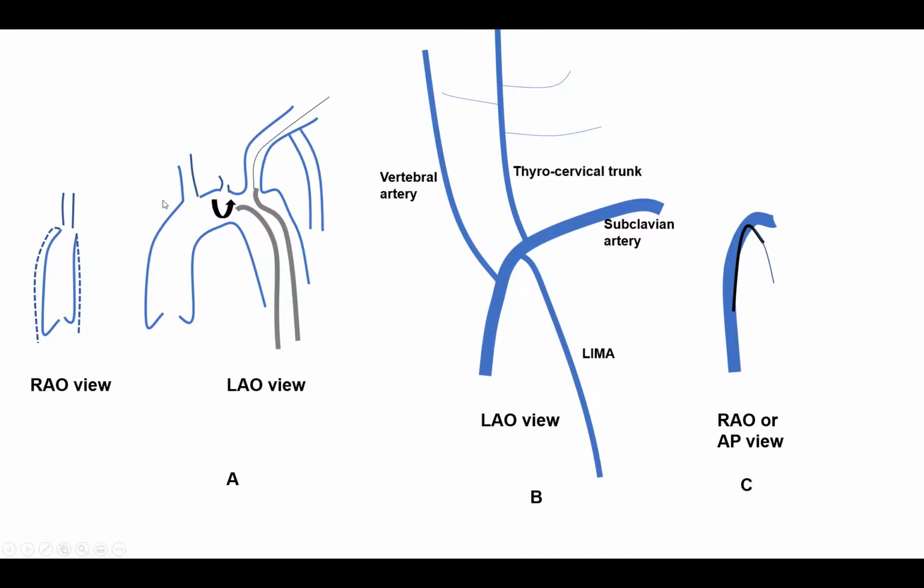Okay. Now, what maneuvering do you do for that? I mentioned counterclockwise to get into the subclavian. To get in the LIMA, it's usually counterclockwise, slight counterclockwise. Occasionally it is clockwise, but the idea is just know this anatomy and make it point down, whatever you need to do. If counterclockwise points you up, reverse it and do clockwise.